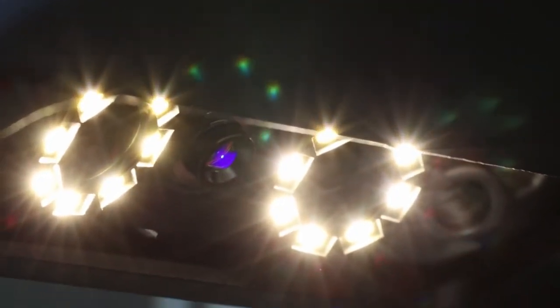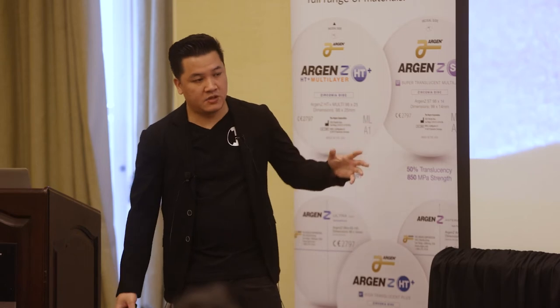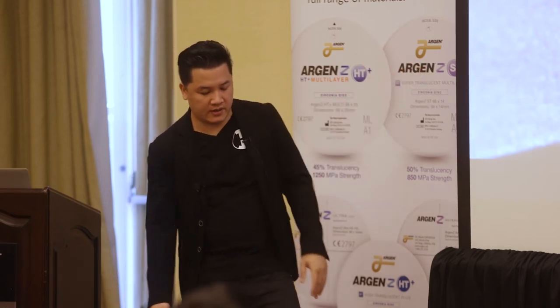And in the lab, the most mature way that we've had for a very long time is desktop 3D scanners, right? And what I've noticed in recent years is with the intraoral scanners being introduced, we are getting less and less conventional impressions. We're probably 60, 70% digital impressions versus 30 to 40 conventional. So this was your first way to get things digitized, but I see this trend becoming more and more, less. So we actually had probably three doctors in the last week get new scanners.